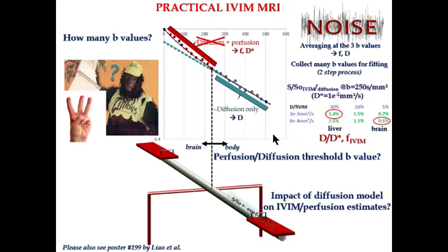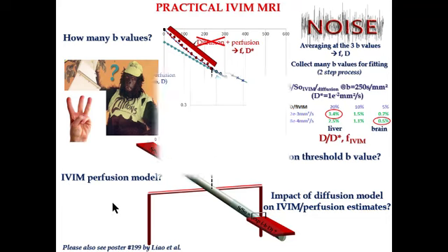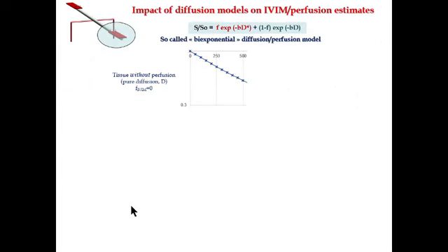Then we have to look at the impact on the diffusion model used to fit this part of the curve. I will show you, and there is also a poster by one of our Ph.D. students here, Dr. Liao. You will see that it's not trivial. So now we get a little bit more insight.